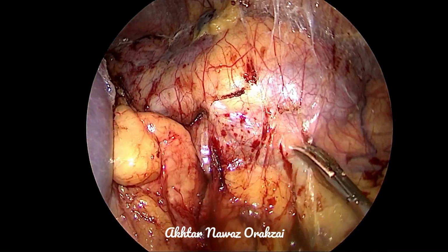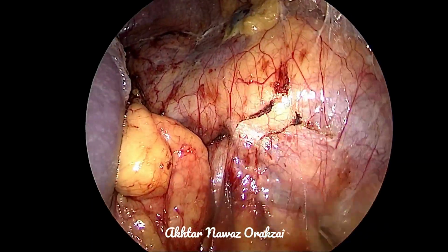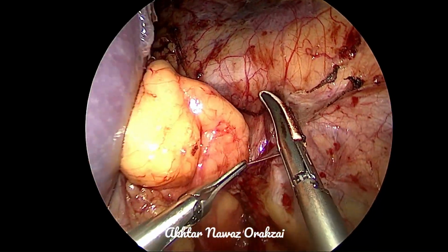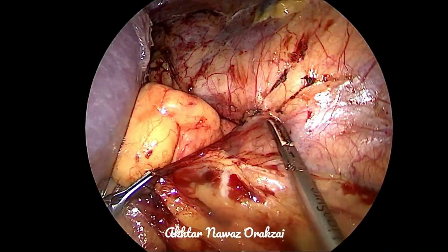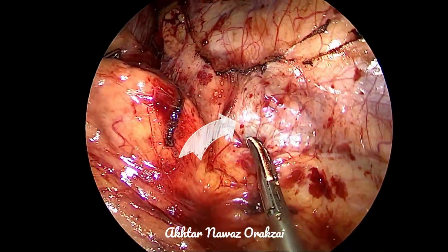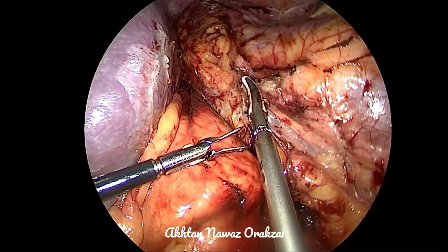So after mobilization of the colon, we identify the gonadal vein, and after identifying the gonadal vein, we just follow it, and this leads us towards our first landmark, that is the renal vein. Of course, we are discussing the left-sided procedure here. This is the renal vein here. The arrow is pointing towards it. So we dissect this and expose this renal vein.